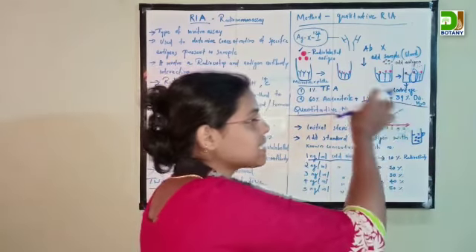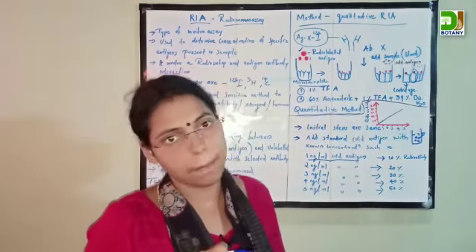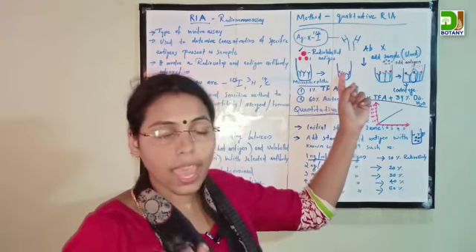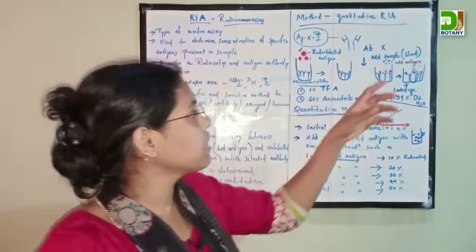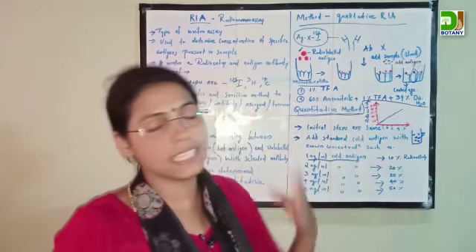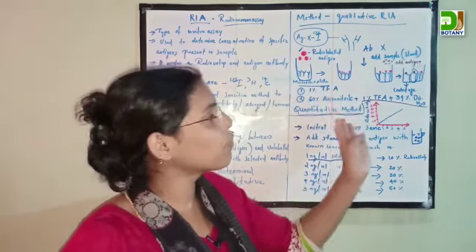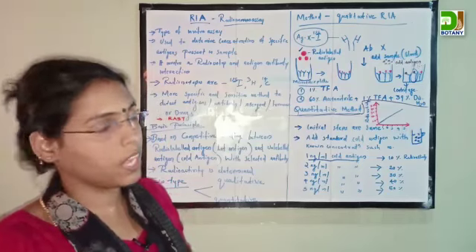Based on this standard graph, we measure the quantity in the sample. We have a blood serum, which we add to the radioactive labeled antigen-antibody complexes. The antigen present in the sample leads to the replacement of radioactive labeled antigens. This replaced, free form of hot antigen is responsible for radioactivity.